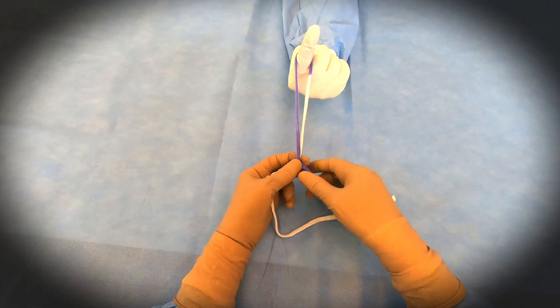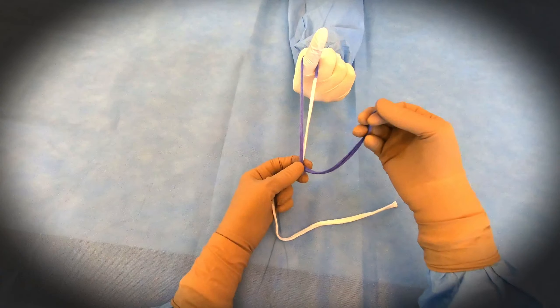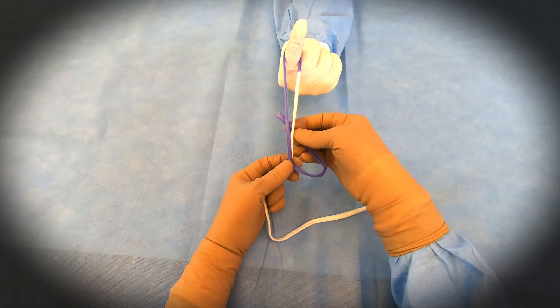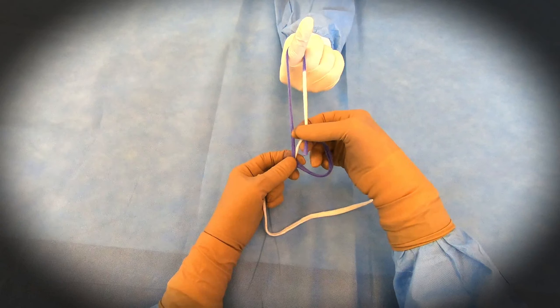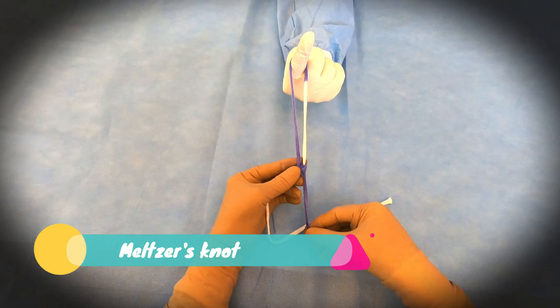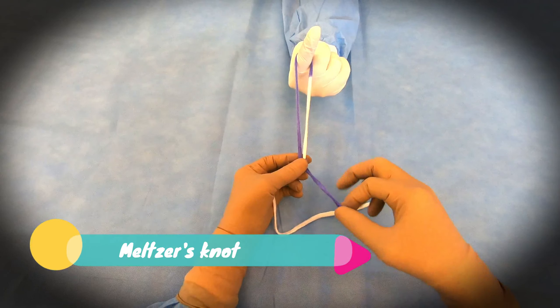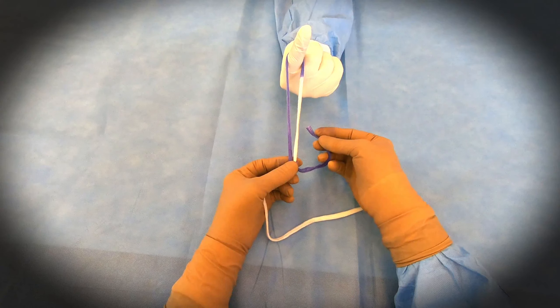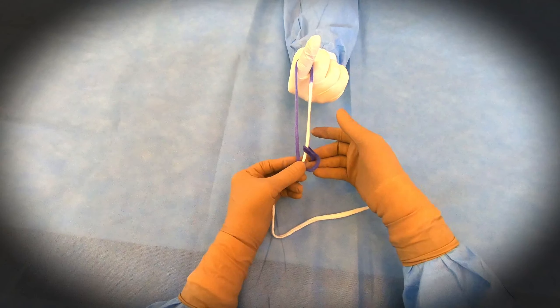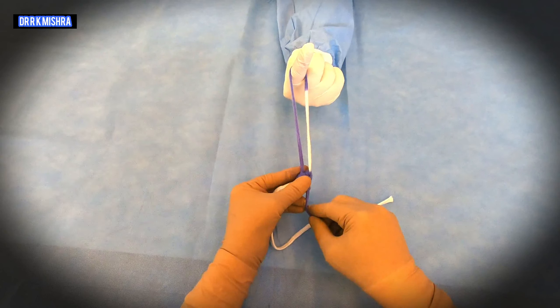So three winds will be taken, and then two locks will be given in the Melgers knot. So it is two-three-two — this is the first lock, that is the half knot on the right side of the limb, and then again you will take the second half knot, that is the second lock on the right side of the limb.